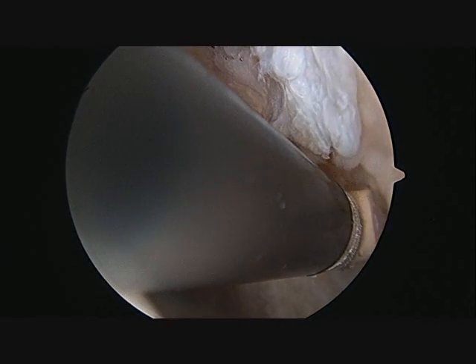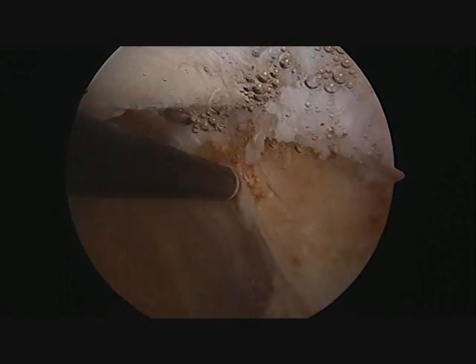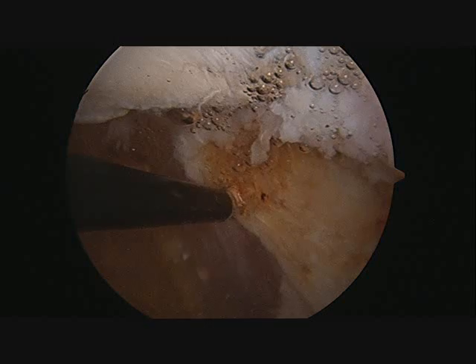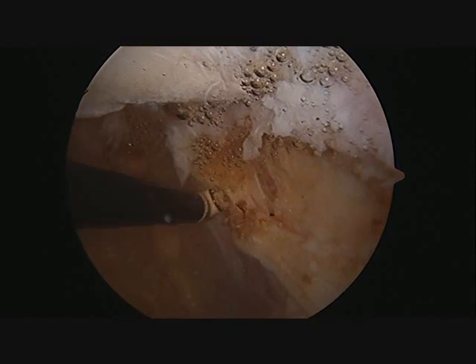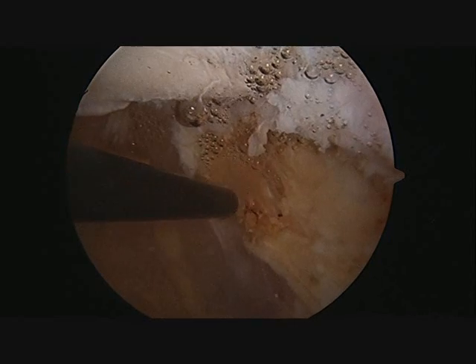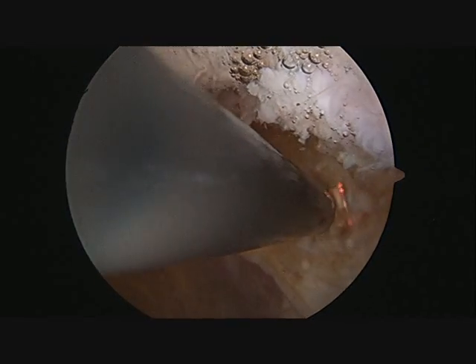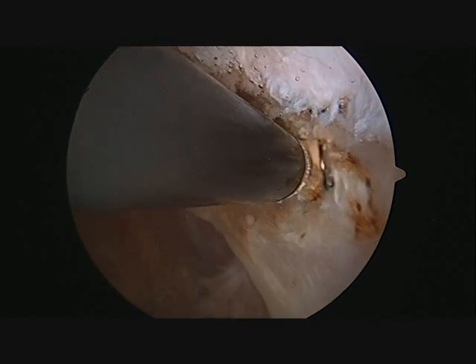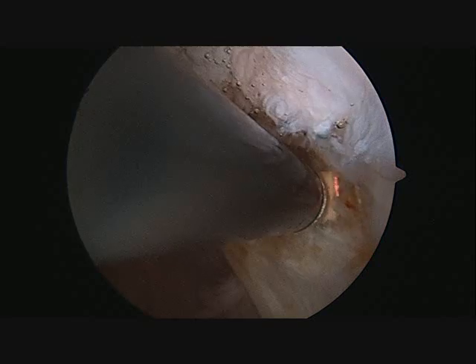The tissue is quite thick and may take some time to be completely released. The release is stopped when I reach the top of the kneecap where the muscle first appears — I can tell because the tissue starts to jump as I touch it with the vaporizing wand. I release as far towards the shin bone as I can safely see, and I can tell when the tough tissue is released when it spreads open and I can see a color change signifying the underside of the skin.